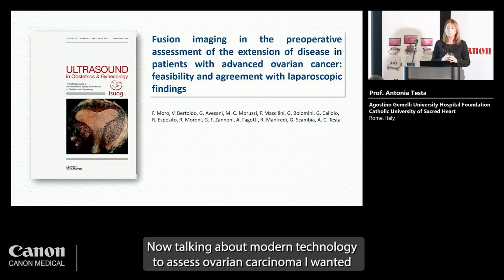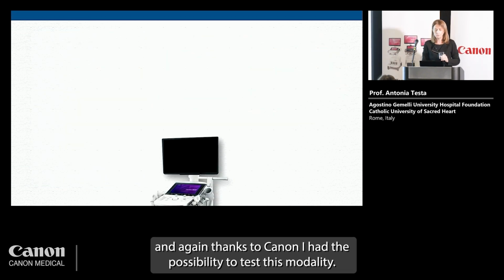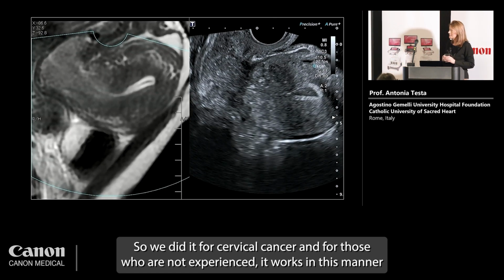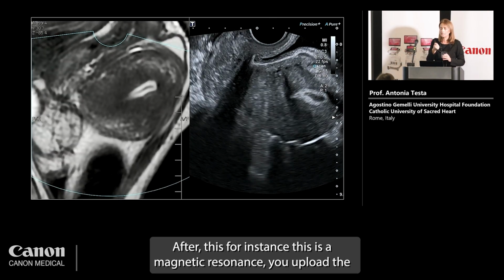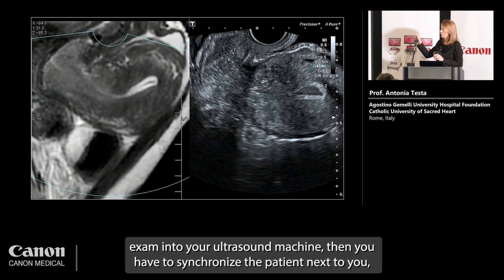Now, talking about modern technology to assess ovarian carcinoma, I wanted to mention also this possibility to use fusion imaging. And again, thanks to Canon, I had the possibility to test this modality. So we did it for cervical cancer. And for those who are not experienced, it works in this manner. After for instance, this is a magnetic resonance, you upload the exam into your ultrasound machine. Then you have to synchronize.